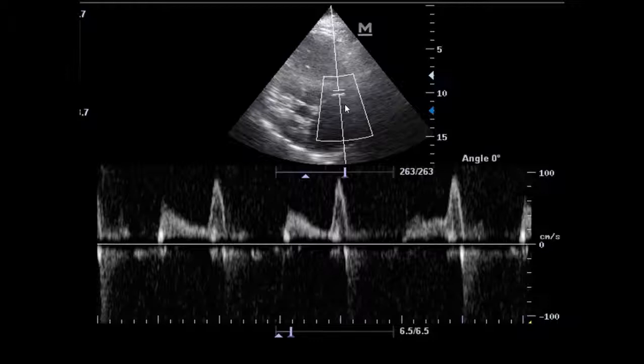So the beauty of the ultrasound machine is that it gives us 2 possibilities for the acute deterioration now: hypoperfusion due to ischemic cardiomyopathy and hypovolemia, and at the same time a possible renal cause due to embolic obstruction of the renal vessels. It's rare, but it could be.